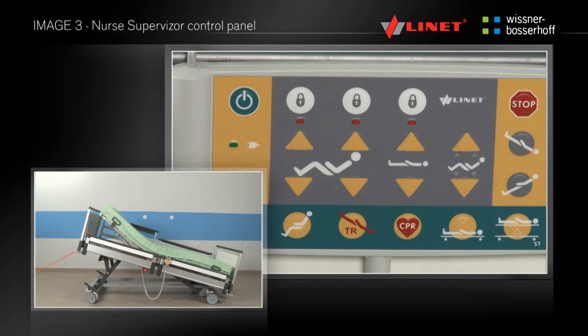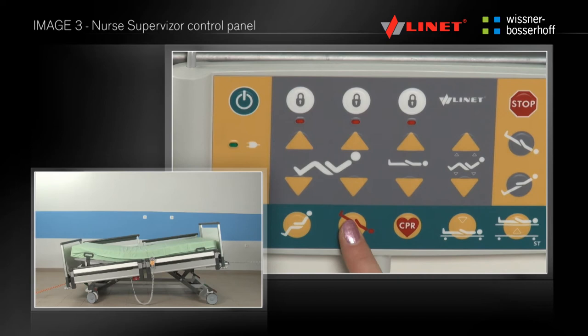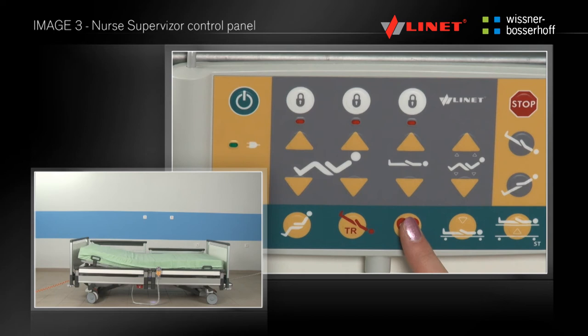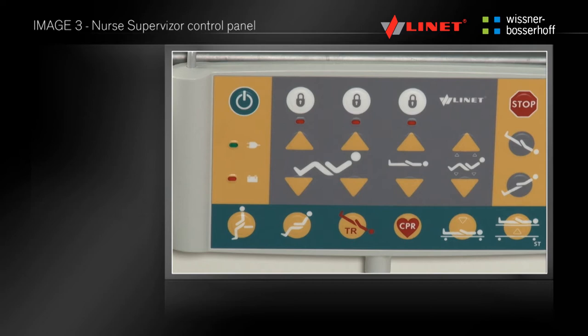In the green area of the main control panel, there are buttons with pre-programmed functions: setting of the rising position, cardiac chair, Trendelenburg position, CPR position — for which you do not need to use the activation key — the lowest position of the bed, and examination position. The red stop button allows you to stop unwanted positioning at any time.